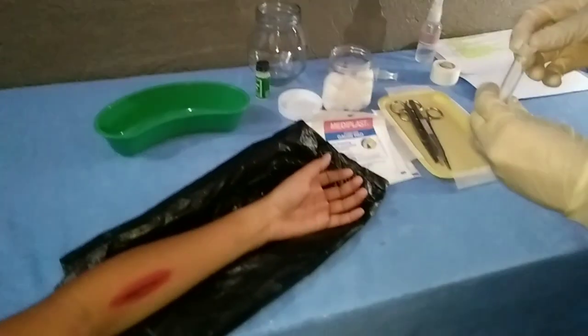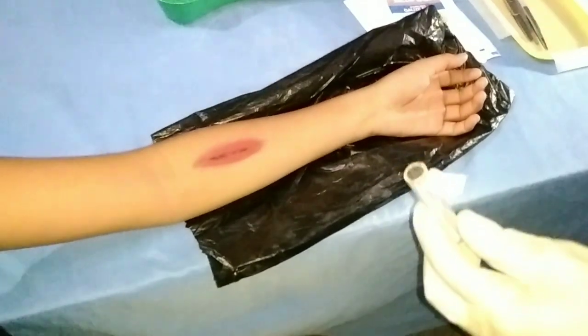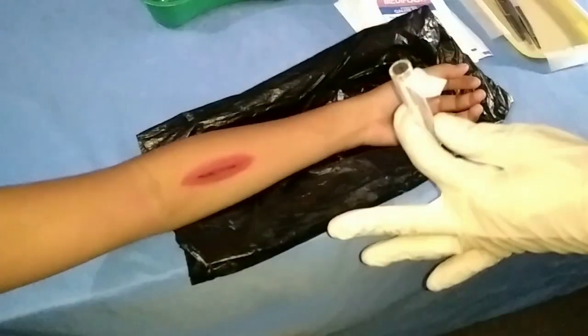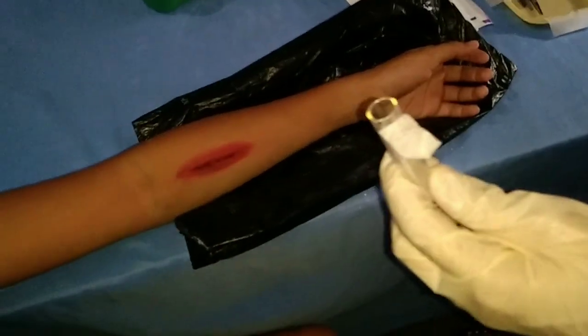So open the specimen tube. Then hold the tube in one hand and take out the swab with the other.